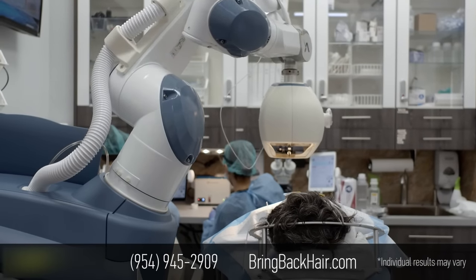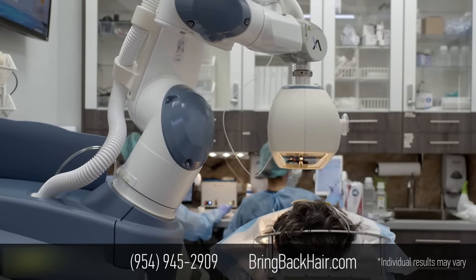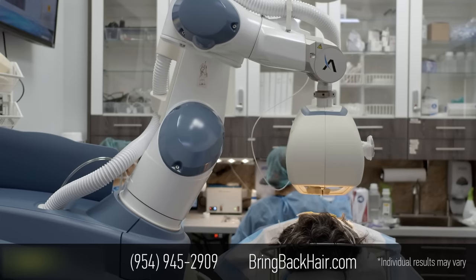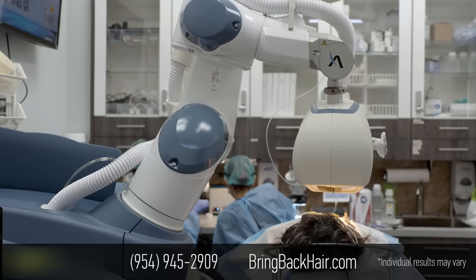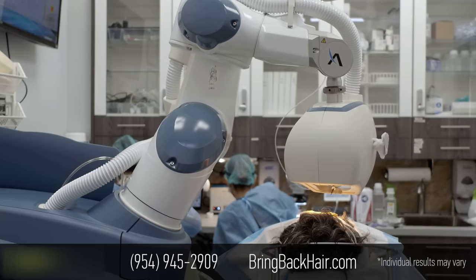So we're about in the middle of the procedure. What makes the 9X different is that the robot actually finds the area to work by itself. Now we can show the screen here.